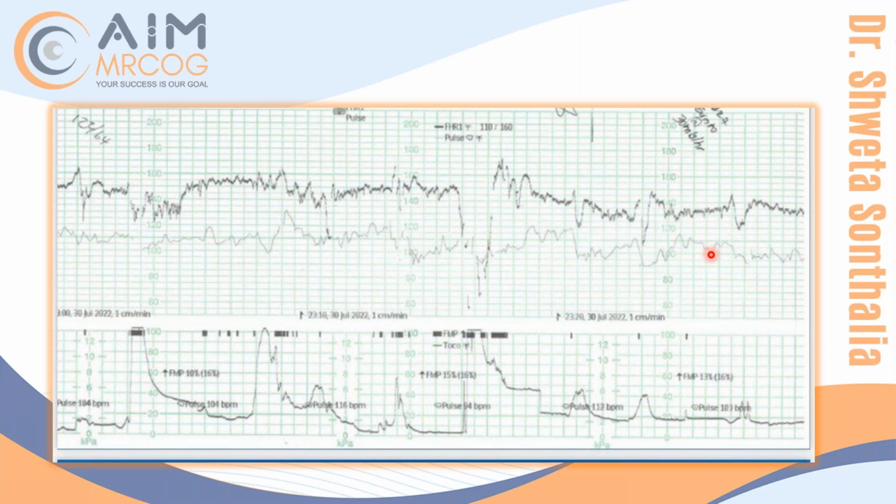So do you think it all looks similar? It's all variable, starting with contraction, ending with contraction. Do you feel the shapes are variable? So what do you think? Is the early deceleration criteria fitting in? No. Then variable decelerations, yes. So this is what I'm telling. Once you want to fit into variable deceleration, you will see that it is wider. There is shouldering. Here is also shouldering, here is also shouldering, here is also shouldering. So it's a variable deceleration, right?